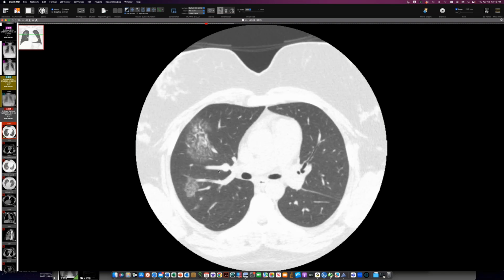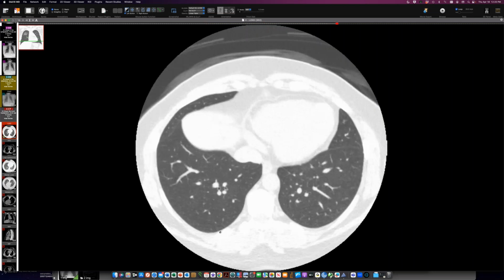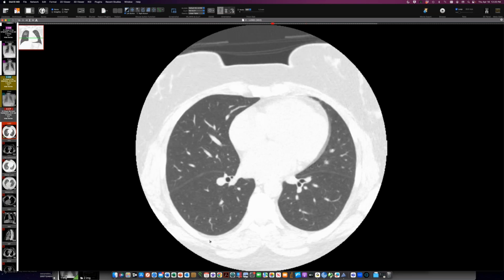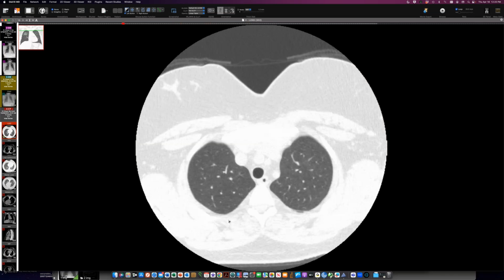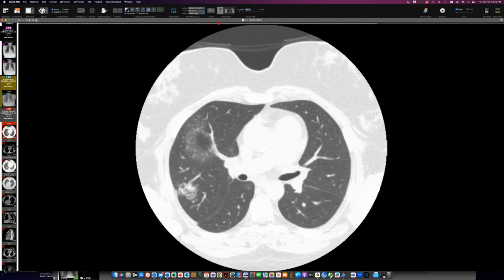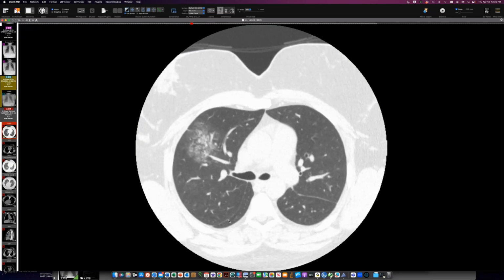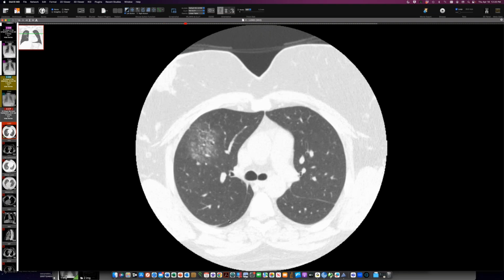So this really looks like organizing pneumonia, and lesions like this have come and gone several times. And there was even one chest radiograph, which I don't have ready to show you, that looked a little like our current chest radiograph with that right upper lobe lesion, except a fainter lesion was present on the left at that point. This person has had biopsy, had lavage, and there was no infection, has had lavage a few times, including on the current round with that distinct right upper lobe lesion. And in the lavage they got lots of lymphocytes back and some neutrophils. So they're calling this organizing pneumonia.